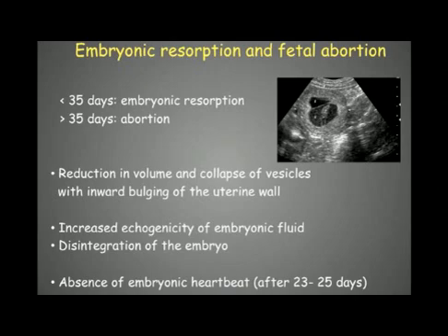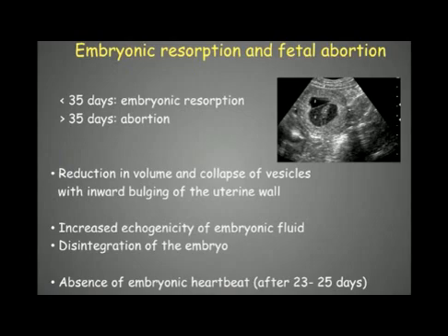We can look at embryonic resorption and fetal abortion. Before 35 days of gestation, we call that embryonic resorption, and after 35 days it's called an abortion. The result is the same: we will see a reduction in volume and a collapse of the vesicle with an inward bulging of the uterine wall. You can see it here — normally if it was viable, it should be filled with fluid and very round, but here it is really collapsed, and this inward bulging is typical of resorption.